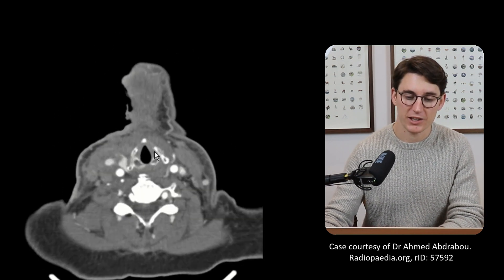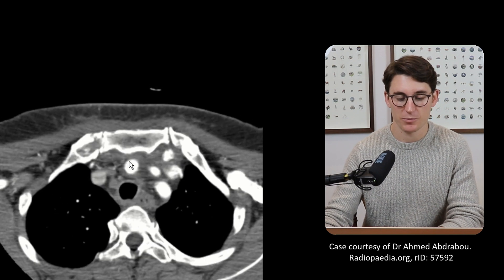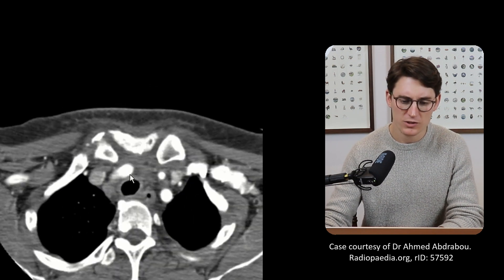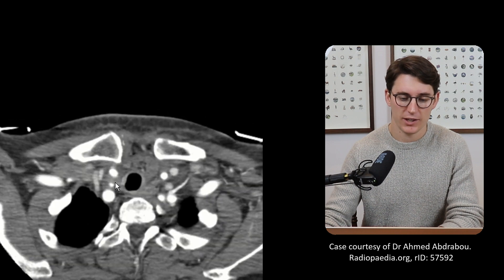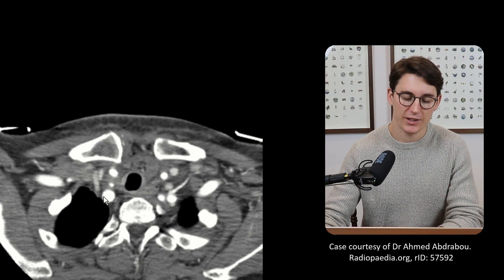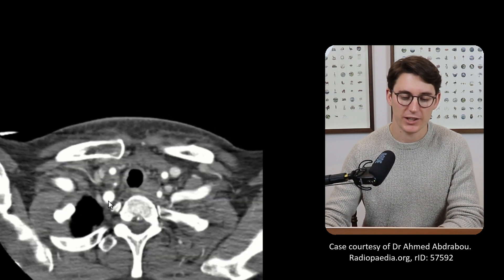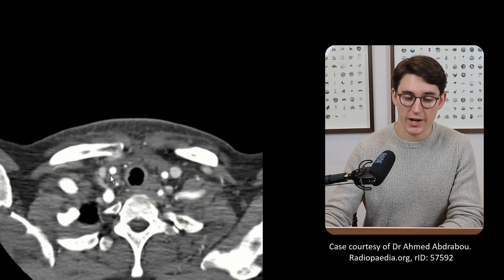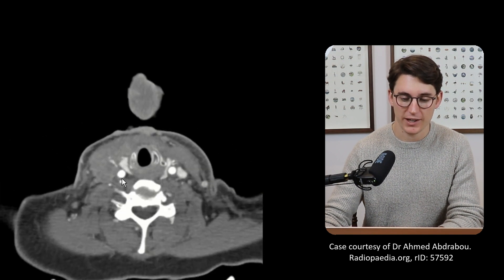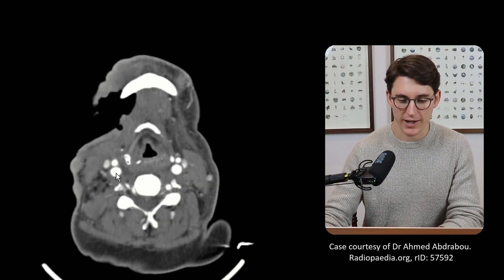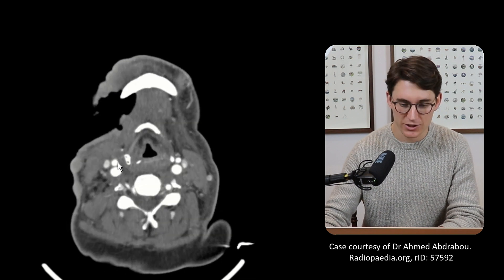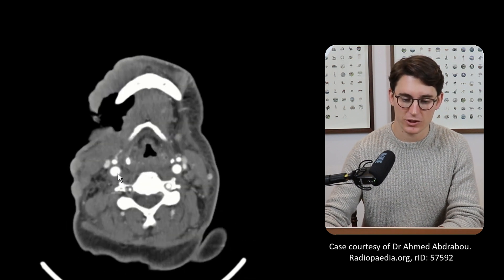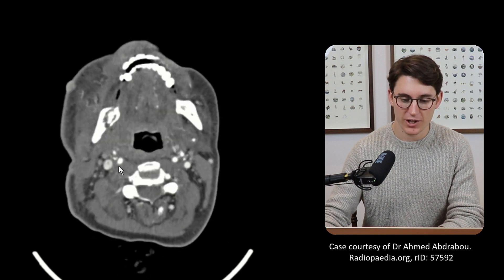So let's go all the way back down and follow the right-hand side — it's slightly different because of the brachiocephalic trunk. The brachiocephalic trunk should split into two — and there we split into two. This will be our right common carotid artery, and this will be our right subclavian artery. Let's just make sure this is a subclavian — it's going out towards the periphery. So let's follow our right common carotid artery; we work our way up the neck. And there we go — we see a bifurcation: external carotid artery, internal carotid artery.